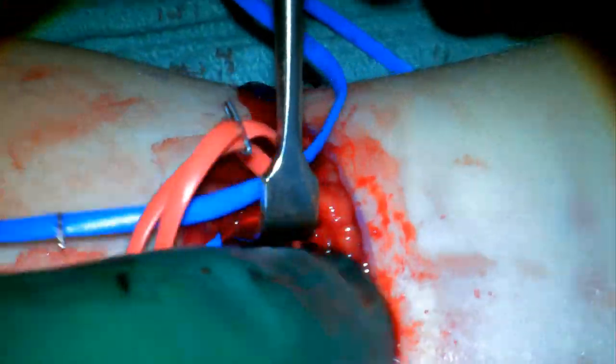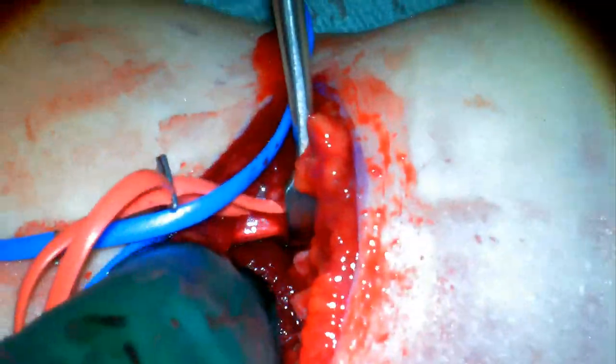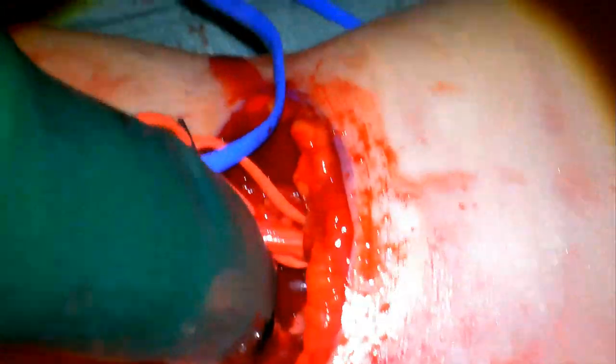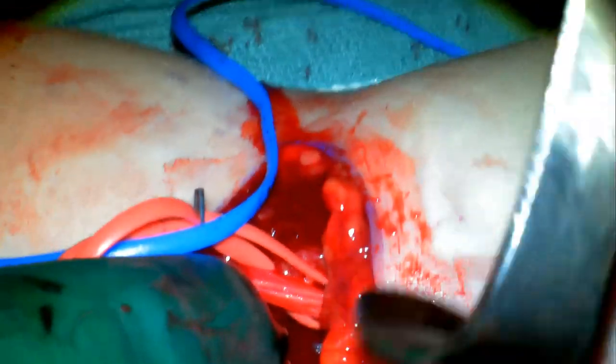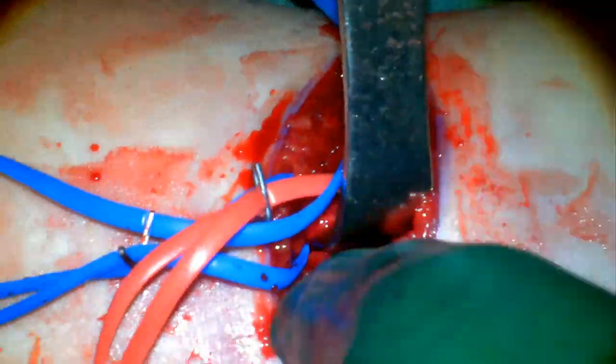So that's liberated there. Sometimes the most important thing to do is just make sure this stuff is out of your fracture site.